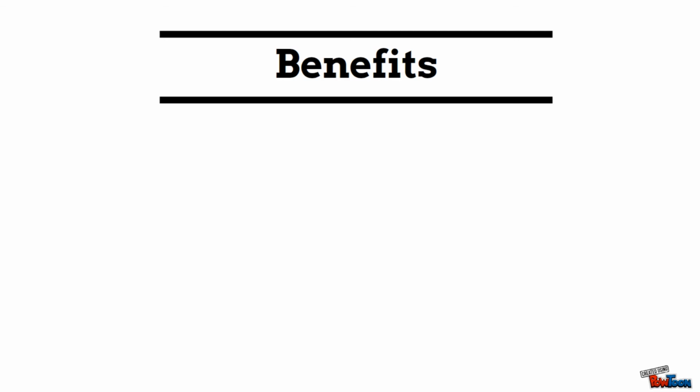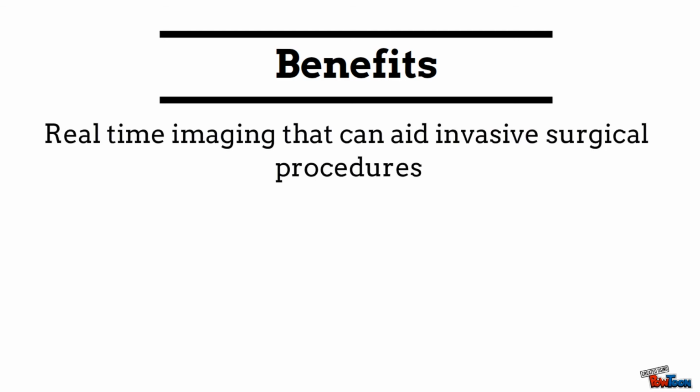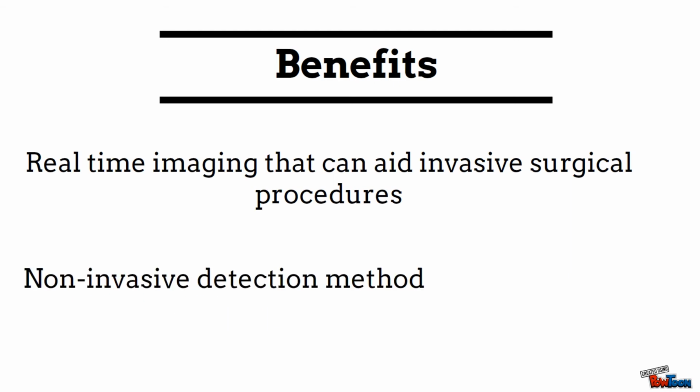Because CT scanning provides real-time imaging, it can be used for minimally invasive procedures such as needle biopsies. Due to its non-invasiveness, it can also be used to detect abnormalities without the need of a surgical biopsy, thus allowing possible early detection of cancer in healthy patients, ultimately providing them with peace of mind.